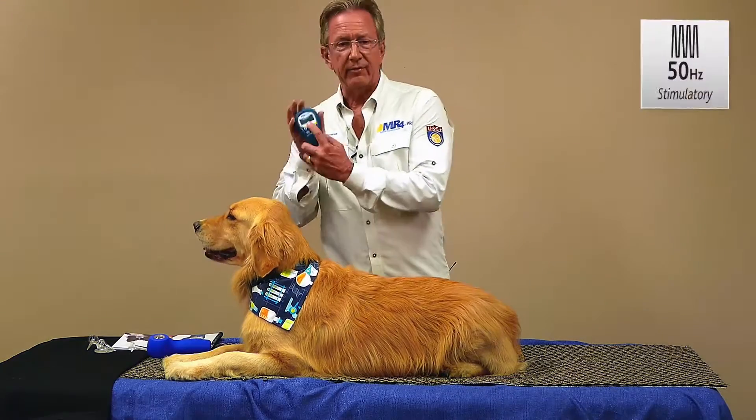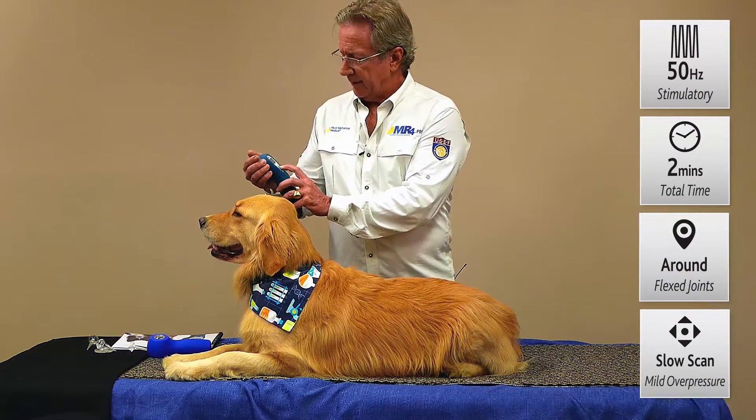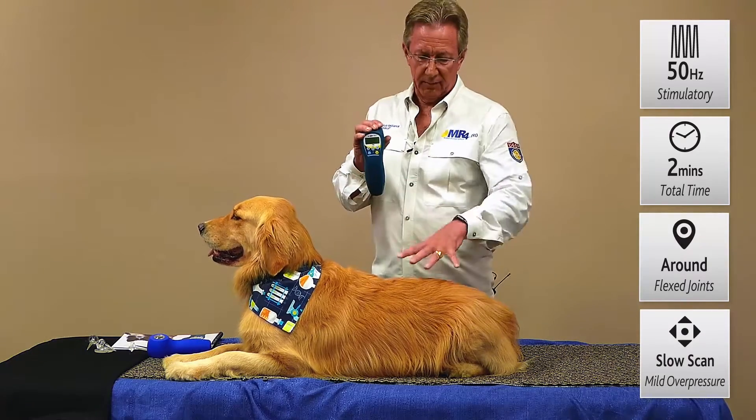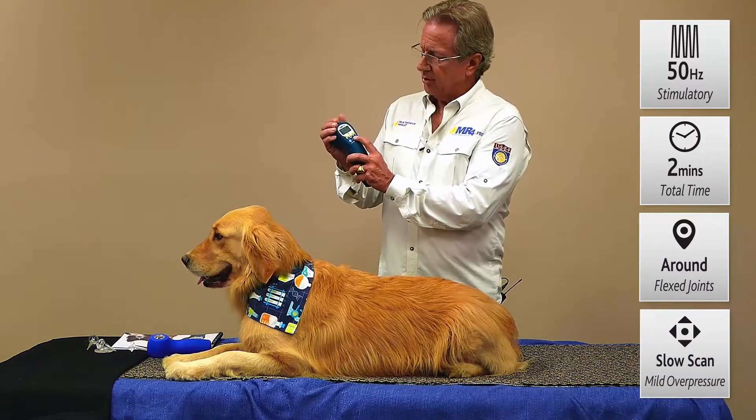Set it up at 50 Hertz for the Activet Pro. Press select, and then we can talk about the time. We'll set that up for 10 minutes so that we can treat a large area at once, and just press start.